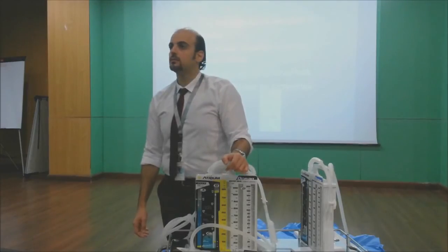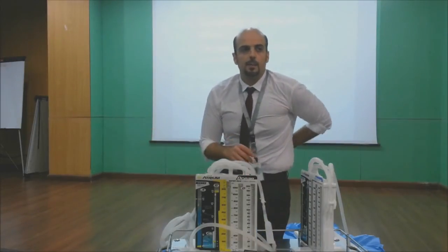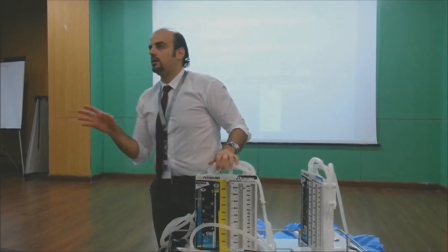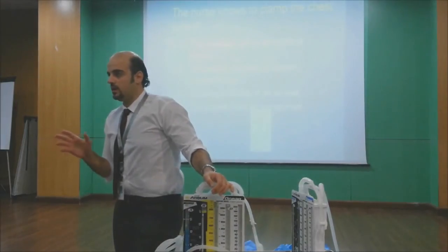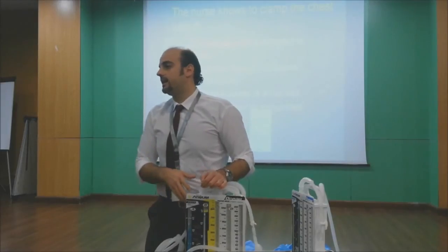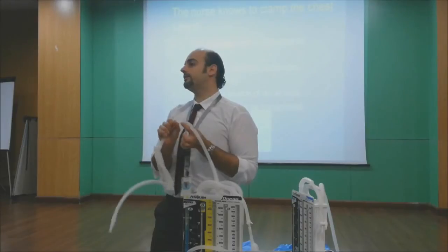So if I find some clots or an issue like this, will I keep it? Very good question, you remind me. Now, according to the policies, we are not allowed milking. This is the most important thing. You are not allowed milking. I don't know why and who put this policy, but if I'm there at 12 at night or at 2 a.m., I found the patient, I look at the chest tube, it's not working, and I found a big clot here. So I'm not allowed to do this?